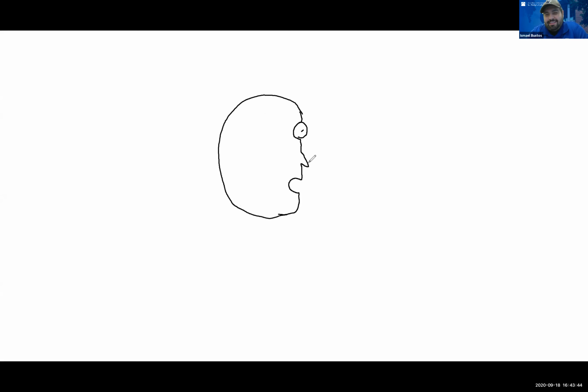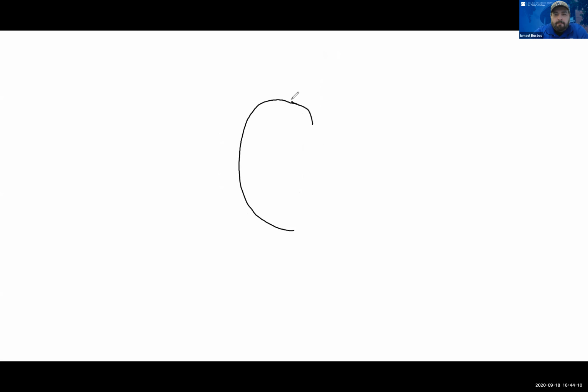Okay, so he looks kind of scary, but that's the guy. And we're trying to get this in a true lateral position. So here is my image receptor, I'm sorry, image receptor's underneath. I don't know why I have it there. Let me erase this. So again, my image receptor is behind him, sorry.